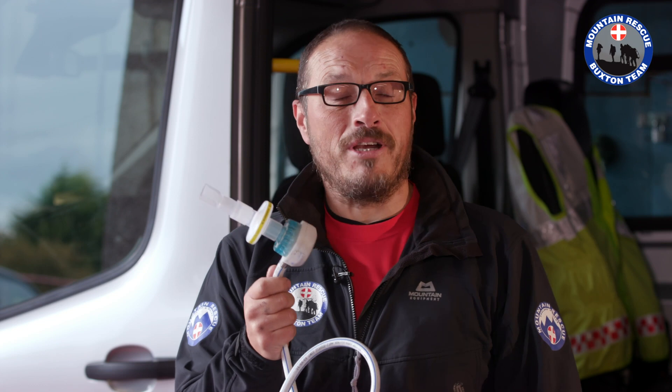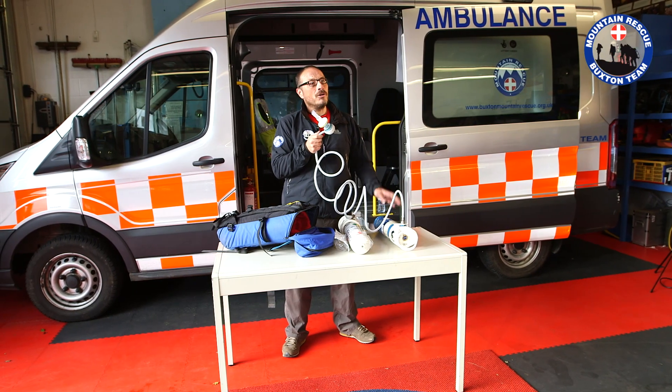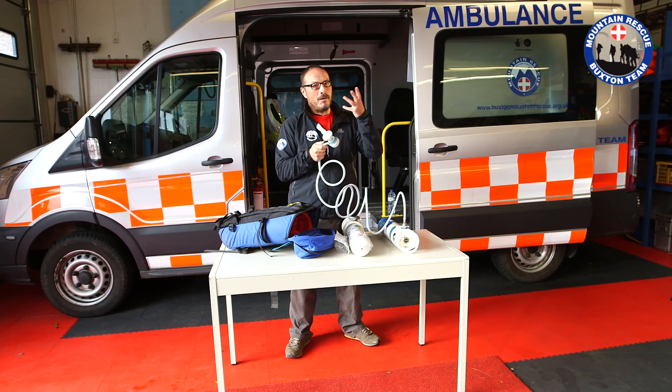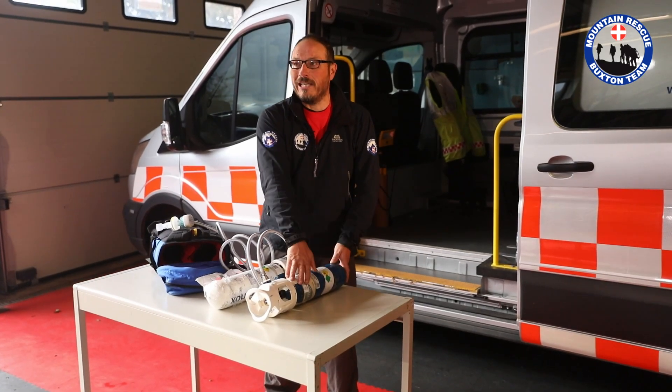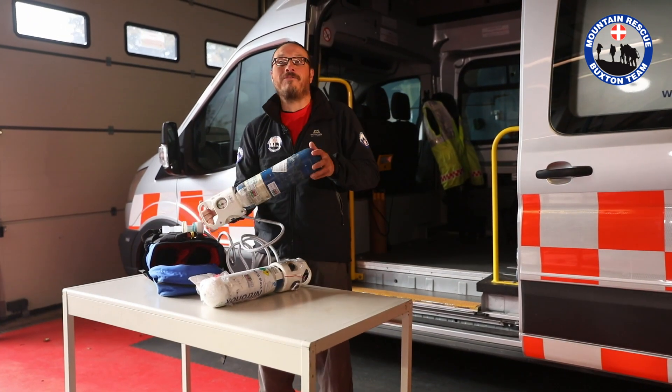Also, peculiarly, if the casualty has been diving recently, we don't want to give them this, because as I said, it contains nitrous oxide and the nitrogen in this process could cause problems to someone who's already got nitrogen in their blood from diving. Another precaution: it's a mixture of oxygen and nitrous oxide and those two gases can separate out in the liquid phase in the bottle. So we have to ensure we give it a good shake, and we have to be particularly careful about keeping the bottle warm if we happen to be out in the winter.